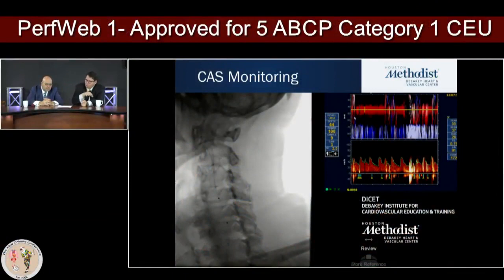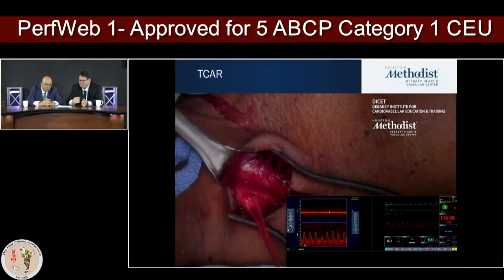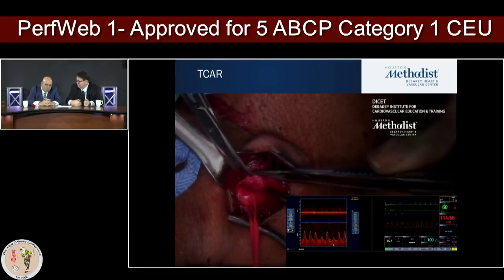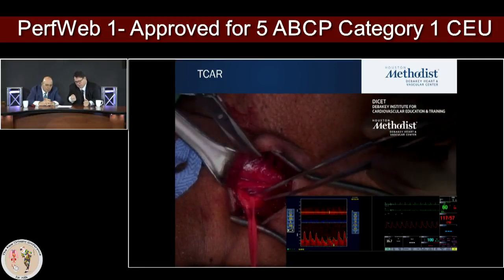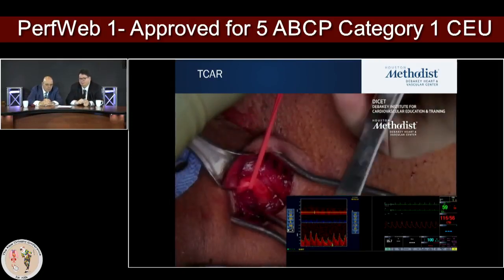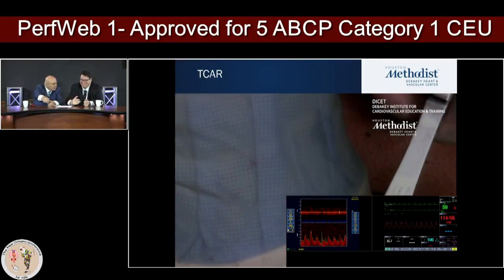And I just want to compare open carotid versus stenting, the same way we compare on-pump cases. Indeed, when we put a stent in, there's debris going to the brain, but also with the recent improvement of how to protect the brain, we can definitely place a protection device so that we are really minimizing the amount of bubbles going to the brain. In this example, you're just pulling on a carotid, look at how the flow changes. But the blood pressure does not. So if you're not monitoring that, you think you're just fine.